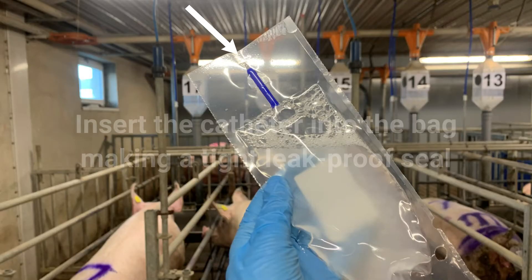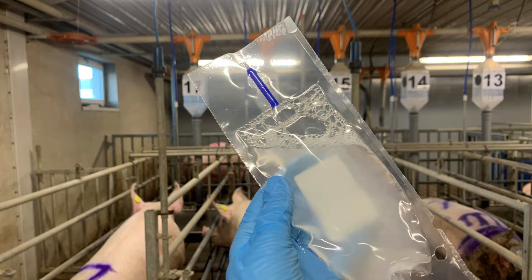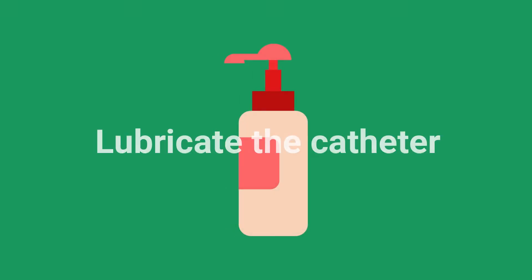Insert the catheter into the bag using a pushing and twisting motion. The catheter should make a tight, leak-proof seal with the bag. Lubricate the tip of the catheter with a non-spermicidal jelly.